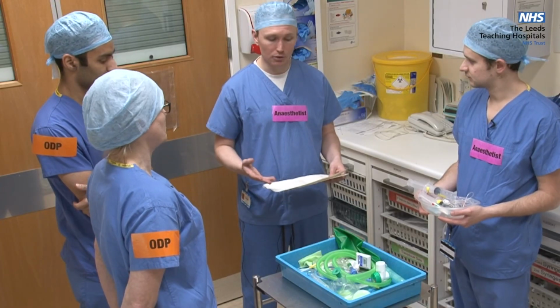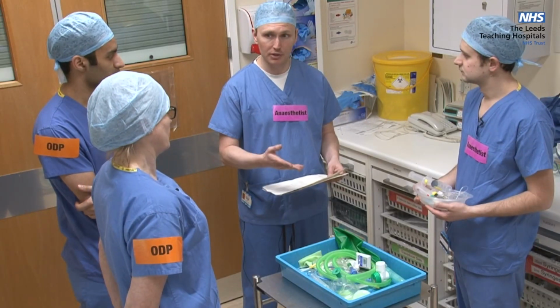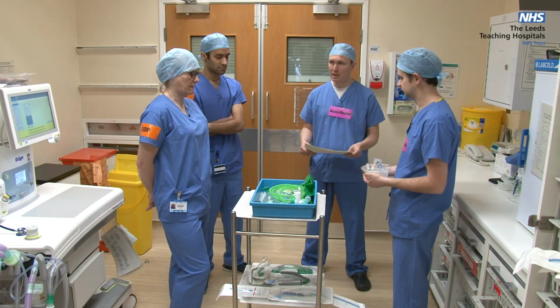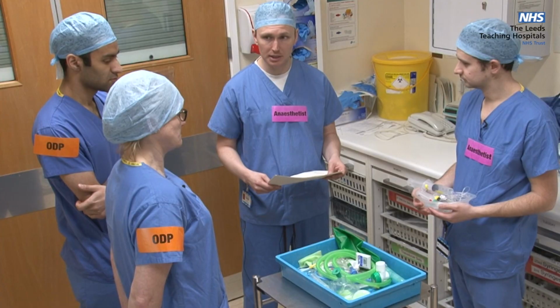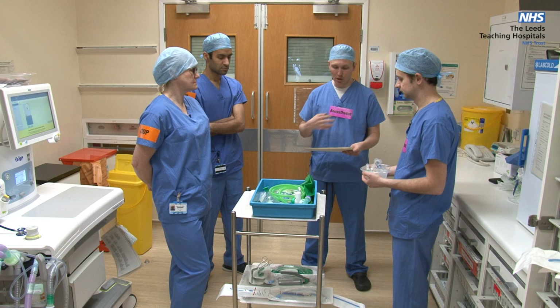So we're going to go through our checklist to make sure that we're all sorted, ready for when we go into the room to intubate the patient. All 4 members should don PPE as per trust guidelines, and we should have all body checked that. Is anyone not happy with their PPE? No. We've allocated roles already, so I'm going to be the intubator.